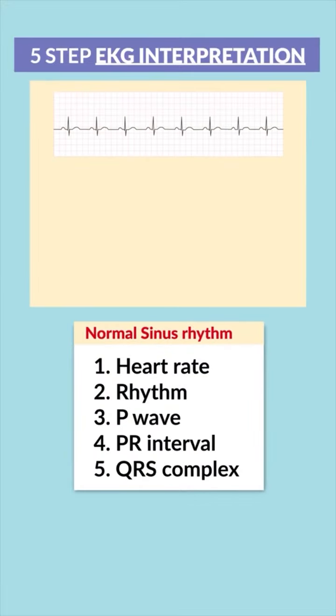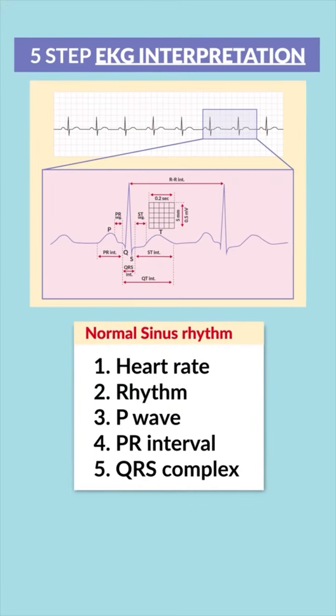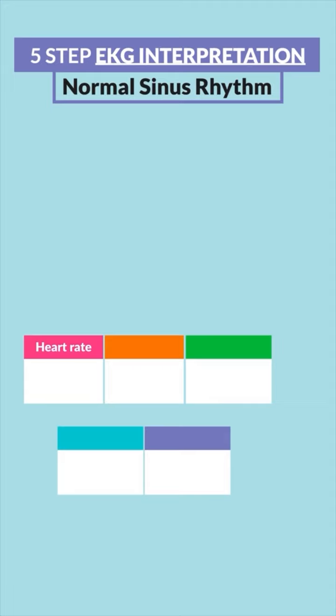These 5 steps to interpret any rhythm in 15 seconds or less. Step number 1 is all about the rate.